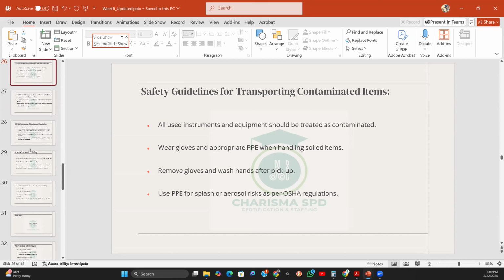But not all surgical technicians work the same way. Some will just collect it and dump it in there, and some will even mix the instruments. That's why we are advising that at the point of use, if we have a surgical sterile technician over there, they are able to say, oh no, this one does not go in this set, it goes into that set, so that it will facilitate or cut down the processing time.